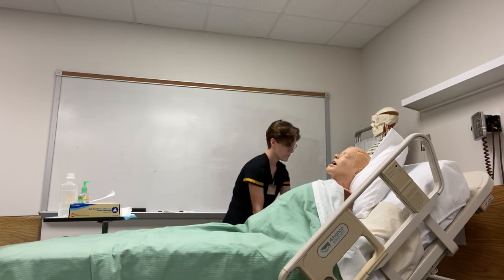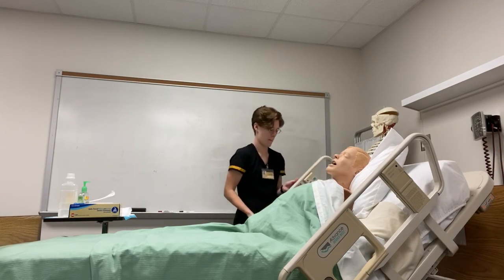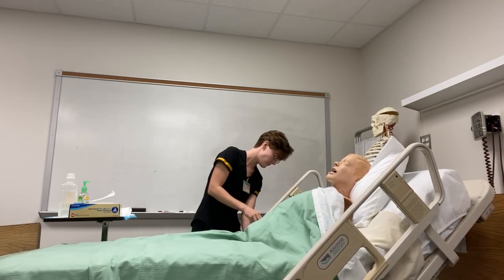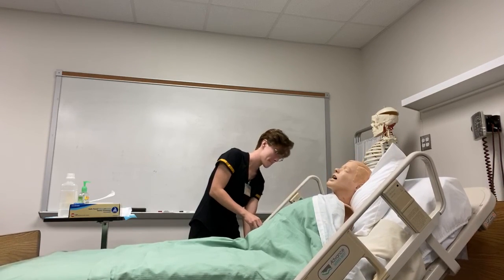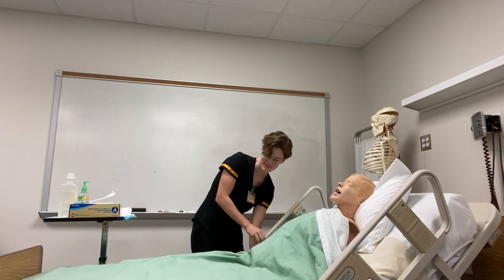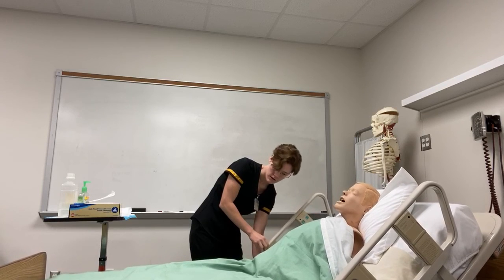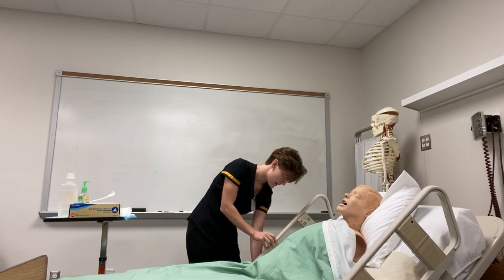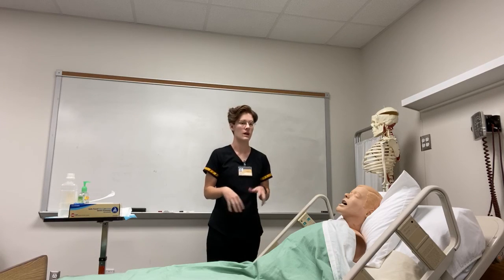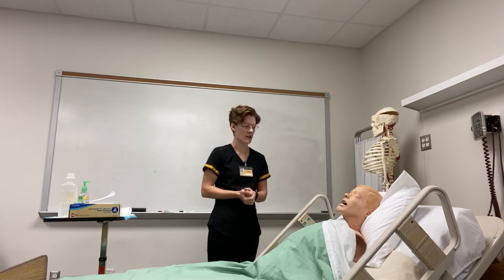Okay, so now I'm just going to put the side rail back up. I'm going to lower the bed. Sorry about the noise again. All right, now that the bed's lowered and the side rail's up, the patient doesn't need anything, so now I would just go on to documenting my information and I would be good to go.